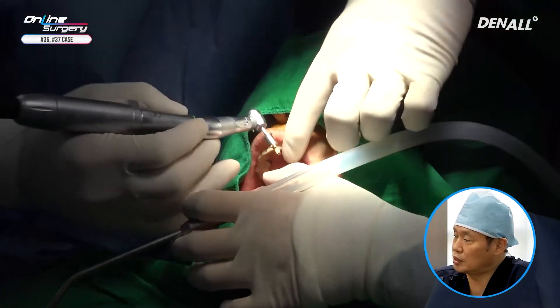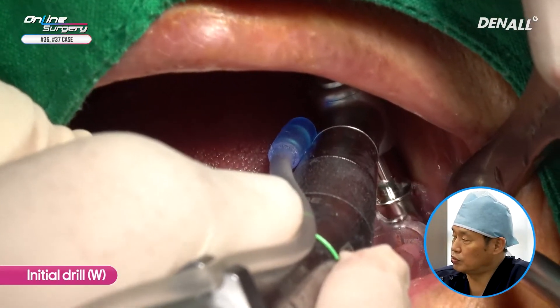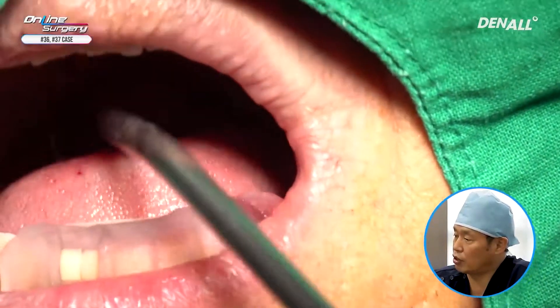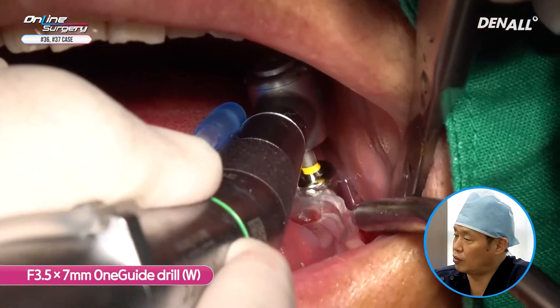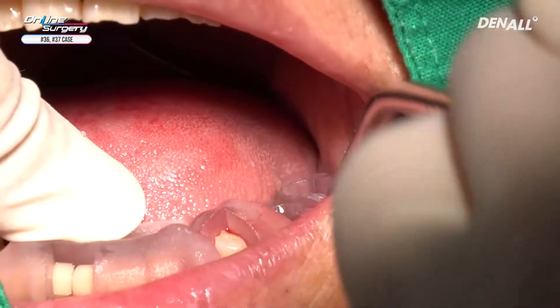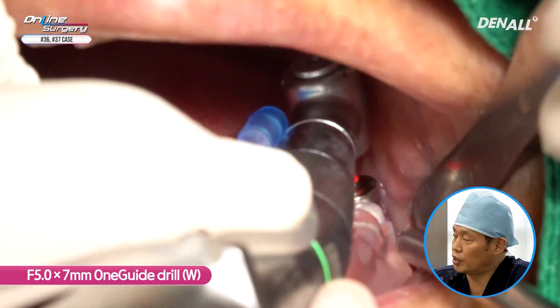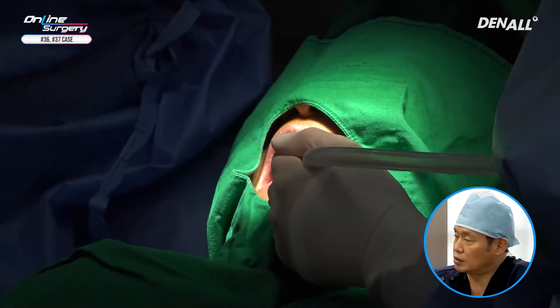Initial drilling is going to be done in number 37. This is an open sleeve type — you need to fit it well into the lingual side, or else the path can alter because this is an open sleeve, so you need to be cautious. Use the closed part on the lingual side. A 3.5 by 7 mm one-guide drill is used for drilling. With an open hole type sleeve, when you drill you need to be more aware of the path. Drilling is now complete.